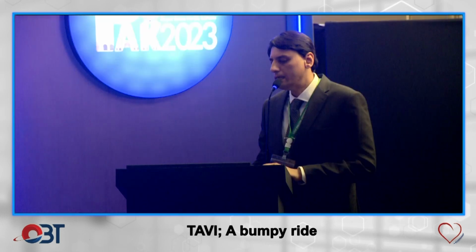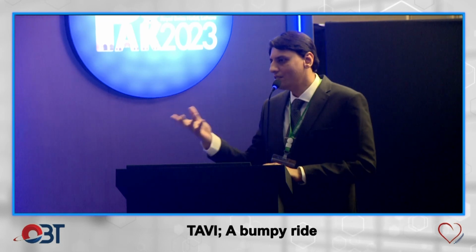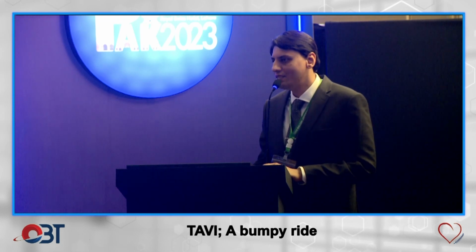And the other thing is, why do you use CT to define the annulus rather than go for the echo, where on the parasternal long axis you can see the diameter of the LVOT? Why do you do the CT? For TAVR valve sizing, it is recommended to go for a CT analysis.